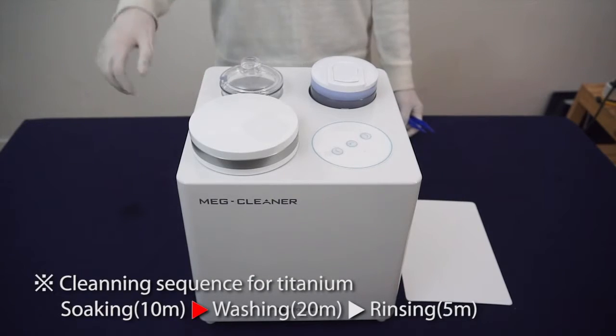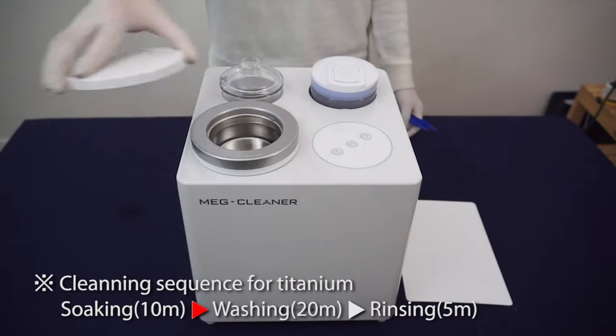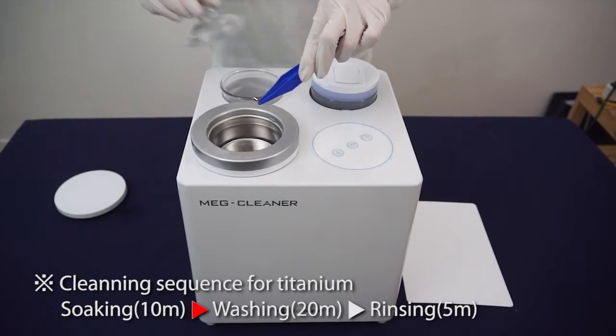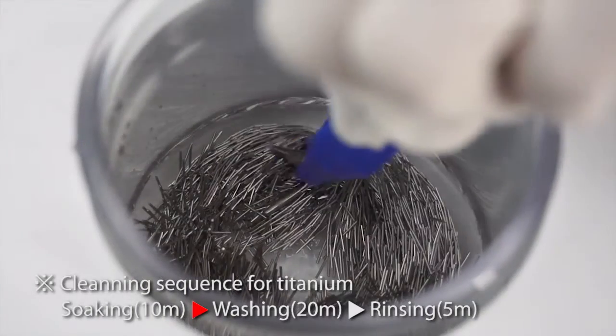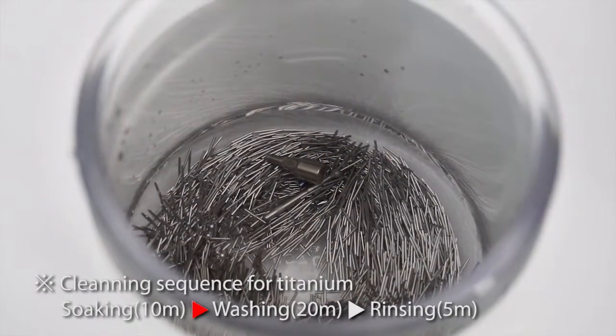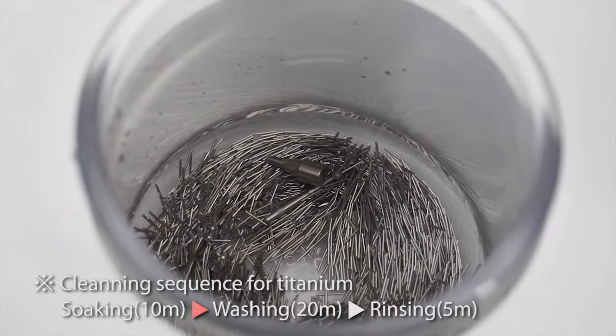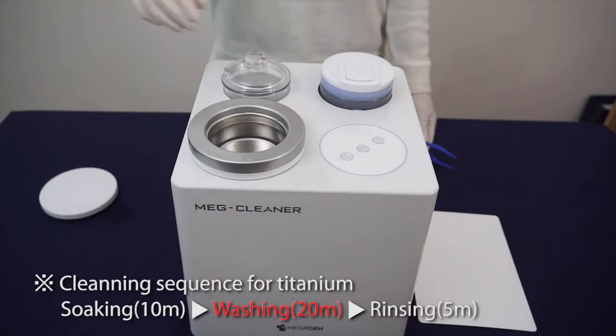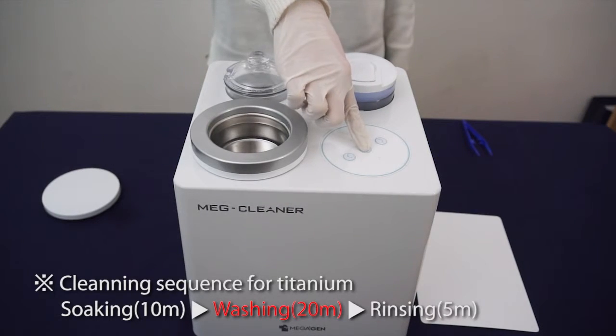After soaking is finished, move the object to the washing jar using plastic tweezers. For more effective removal, put the object at the edge of the washing jar. Turn the washing switch on and wait for auto power off after 20 minutes of washing.